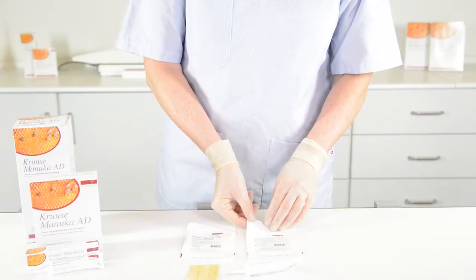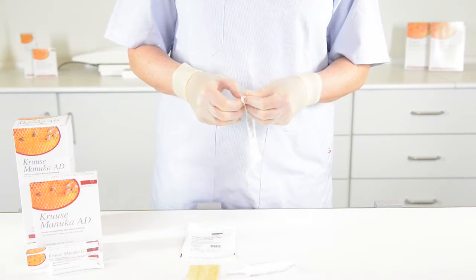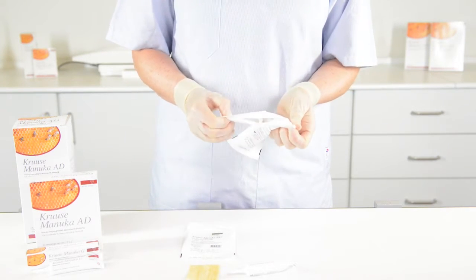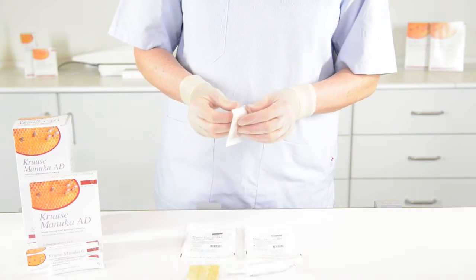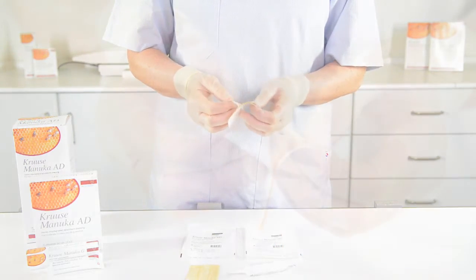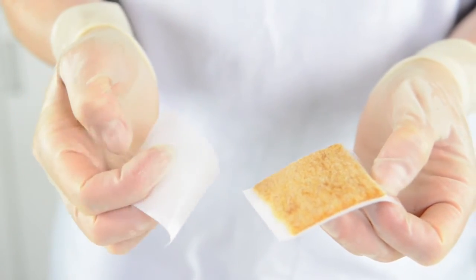The next one is the AD, which stands for absorbent dressing. This one is a bit different — the honey is completely dissolved in absorbent hydro fibers.